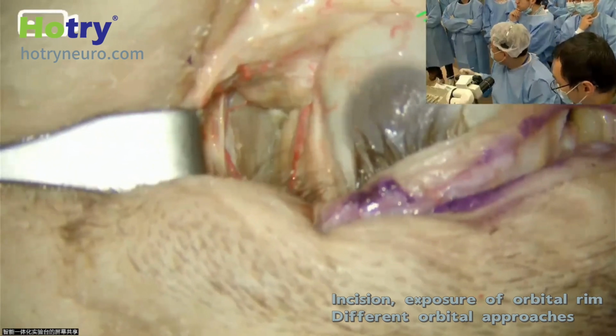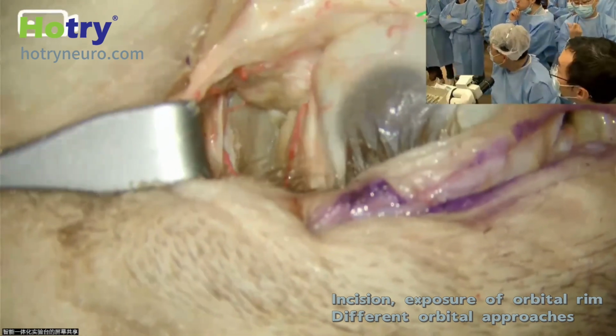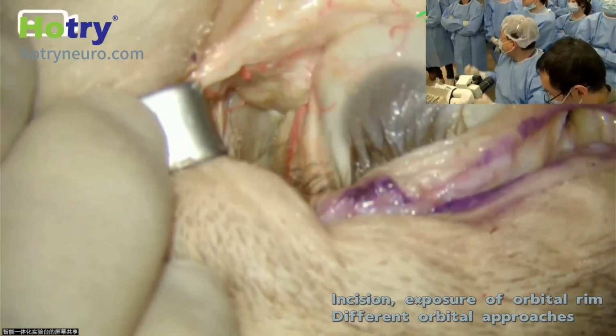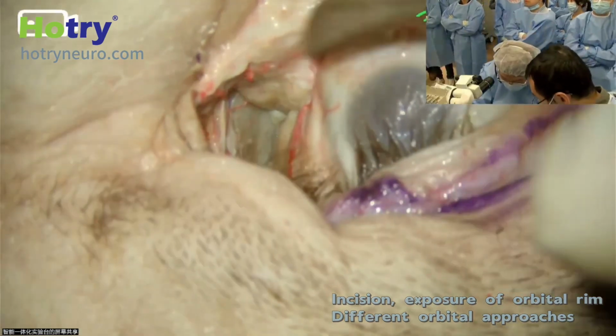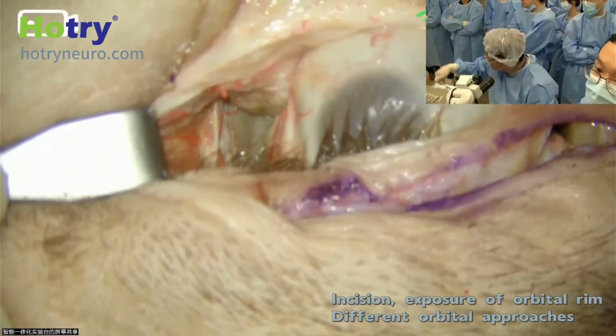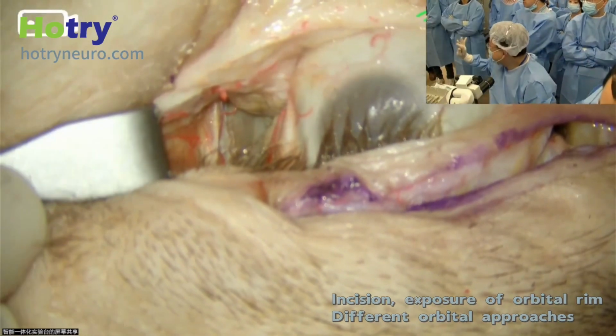So this is what we have just discussed yesterday: endoscopic transorbital surgery. Previously, what we did was use our naked eye. And the first part is nice. But when we go really deep inside, we can't see clearly.